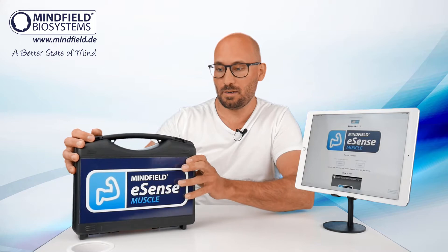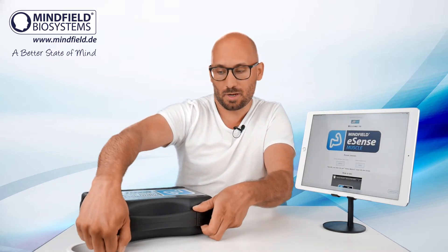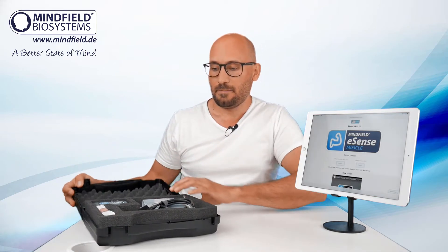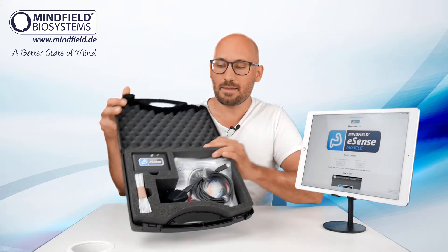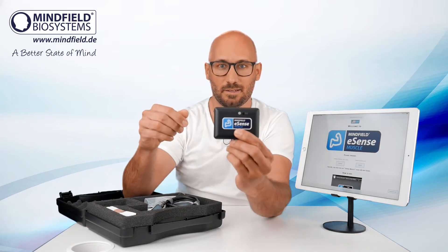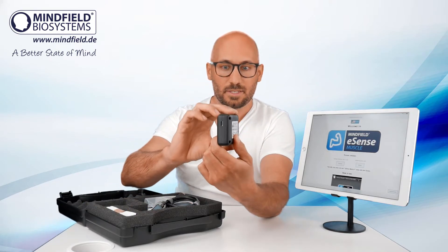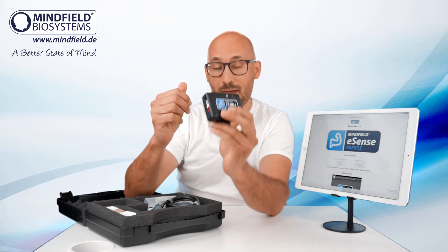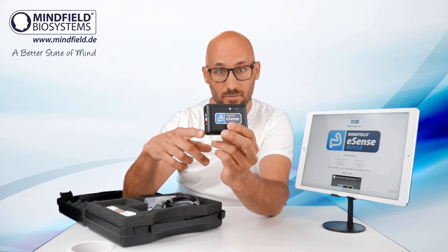Now let's have a quick look into this box, into this little suitcase we deliver. This is how it looks like and here is the eSense muscle itself. This is the sensor unit with a battery allowing 12 hours of continuous operation.